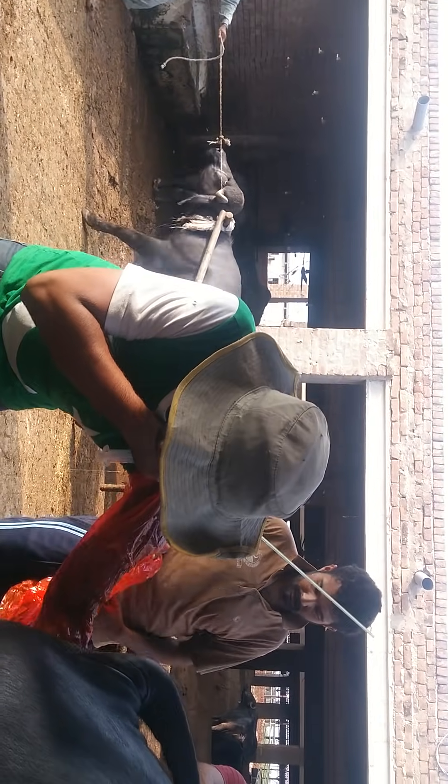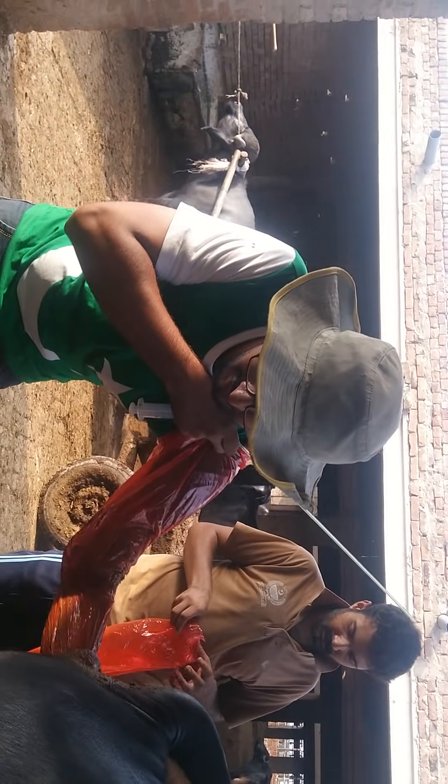This animal is not having any sort of discharge or any sort of pus in it. I am just using this animal for the sake of learning, for the sake of teaching.